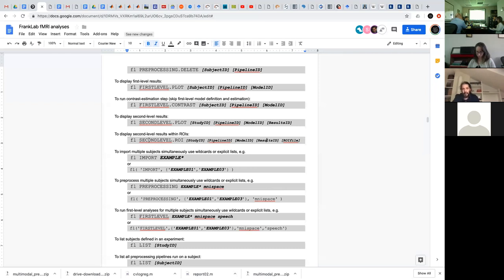But I imagine that there will be scenarios where you might not want to do that, and you want to specify to our scripts that you want to use a weighted average, or a threshold that is not 0. So I don't know, take the values that are above 0.5, and those are going to be the ones to define my ROI. So do you think this is useful, question one, and how do you think we should add that additional information, basically potential thresholds for your ROI file and a potential option to interpret the numbers within these ROI files as weights for doing a weighted average instead of just raw averages? So what do you guys think?